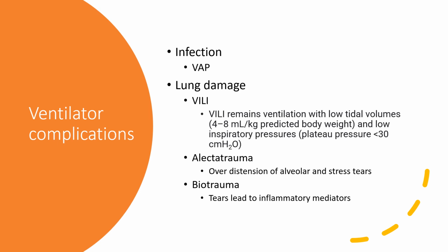Ventilators can be life-saving, but they can also be bad. For example, the longer a patient is on the ventilator, the greater likelihood they might get a pulmonary infection known as ventilator-associated pneumonia. What happens is microaspirates go around the endotracheal tube and go into the sterile lung field, causing infection. A certain percentage of patients who are on mechanical ventilation end up getting VAP. So the idea is to get them off the ventilator as quickly as you can.